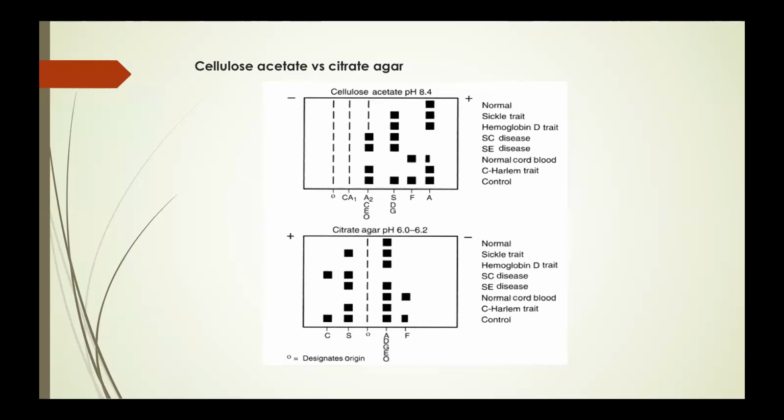So you will have hemoglobin A, which is normal, and hemoglobin S, which is abnormal. From here, you can see this band represents A, and this band represents S. You will also have a small band which represents A2, because A2 is a very small amount, like 3%. That's how you can know this person has sickle cell trait.